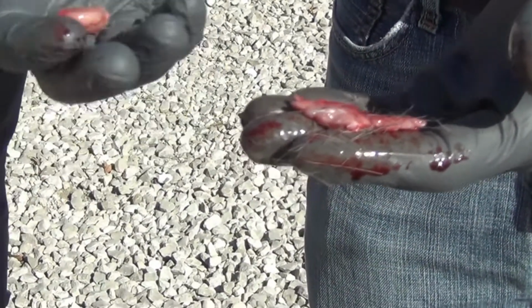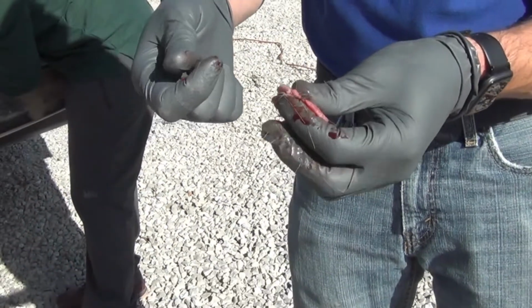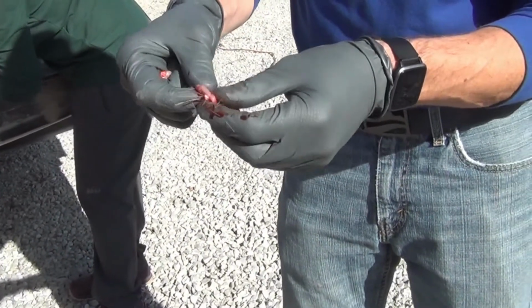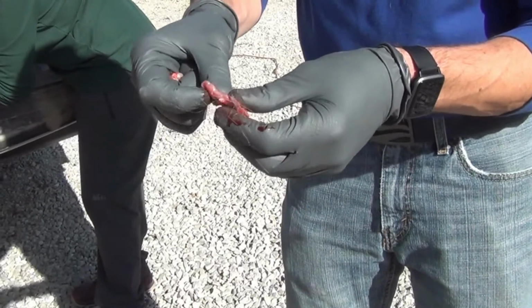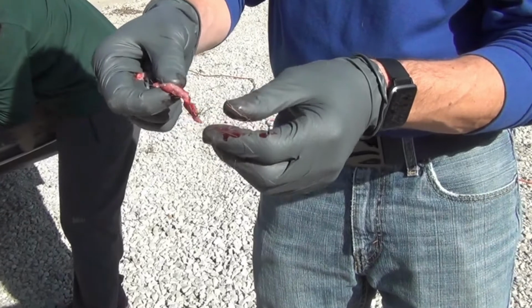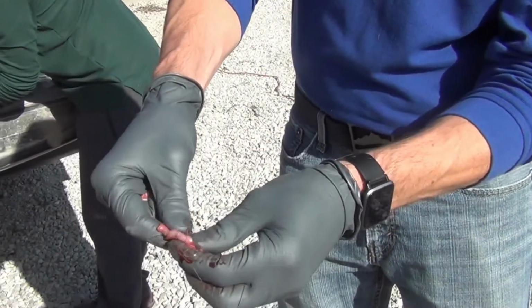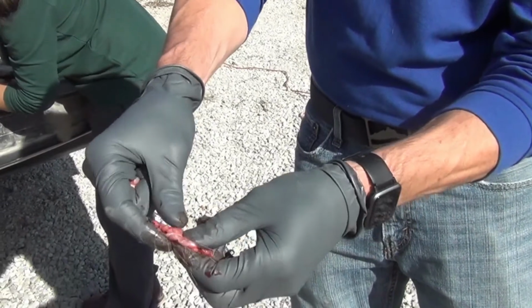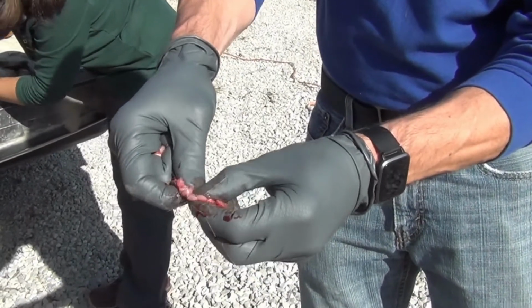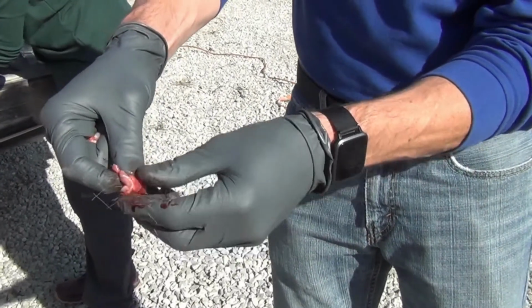But what I'm going to try to describe here, what you're not getting in the video, is actually the feel of the two tissues. As Dr. Rudin mentioned, when it's colder, this salivary gland tissue is going to be much more rigid. It's going to feel a lot more solid than it actually is. But oftentimes, if you pinch it between your fingers, you'll notice that it flattens out and almost breaks apart.